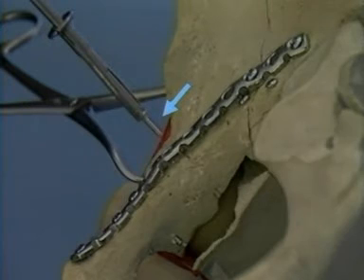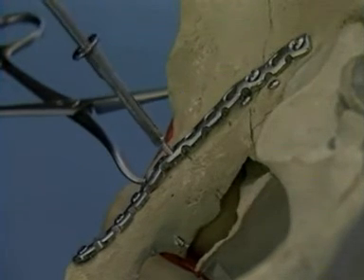Only very short screws should be used over the pectineal eminence to avoid entering the joint.